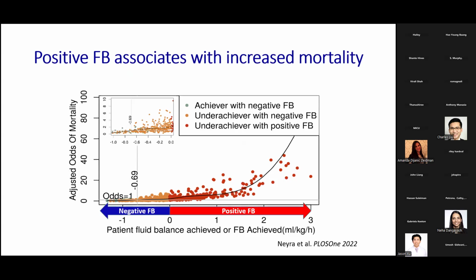Now, new evidence arises about what happens when a patient was already initiated on renal replacement therapy, and we are now determining how we should manage fluid in that patient, how aggressive, what the targets are, and whether we have anything that can guide our decisions on how to do it, right?